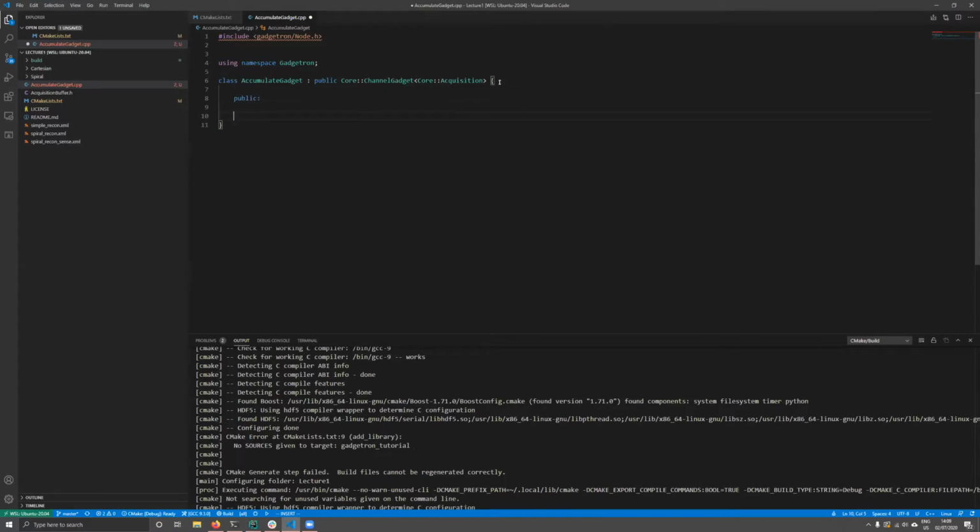So the first thing our C++ class needs is a constructor. Now we could cheat and just borrow the constructor from the channel gadget, but it's sort of nice to know what you need for a gadget to actually work. So it needs a context. The context includes things like the dataset header and the paths to where Gadgetron is actually running from, that sort of thing. And then it needs some properties, which you just go ahead and hand on to the channel gadget that is the superclass.